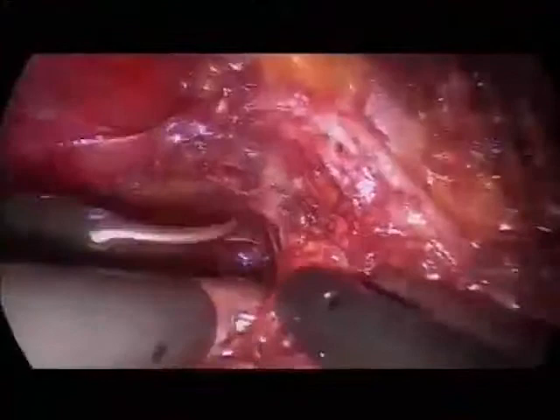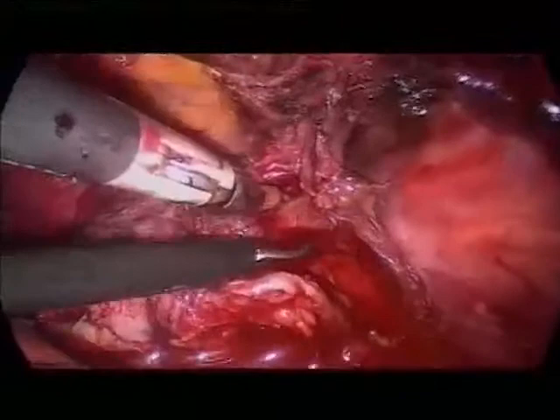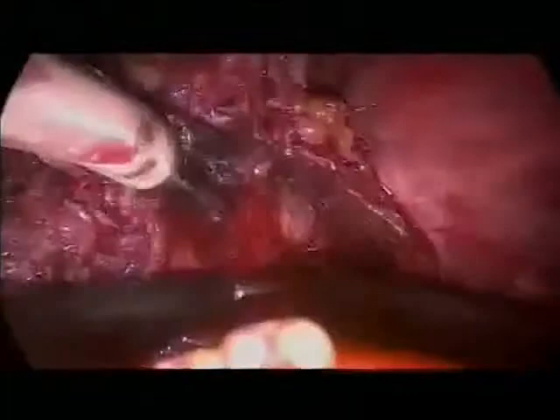Okay, it's mobilized here. Okay, other side. Could you show a little bit what the critical points are here? At the apex, I think the apical dissection is also very important. Especially when we cut the apex, it's very important because this is the area where we have the highest risk for positive margins, and high risk of bleeding.